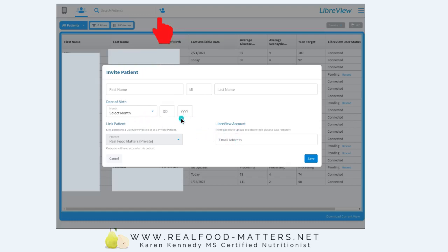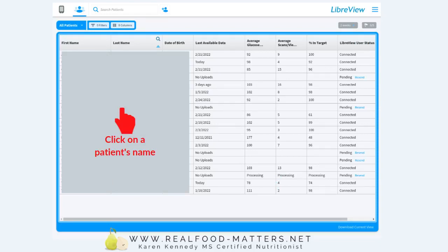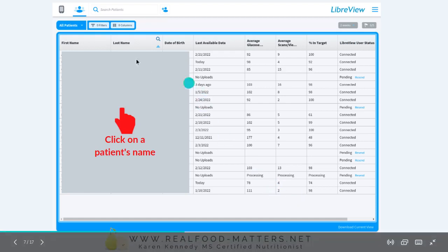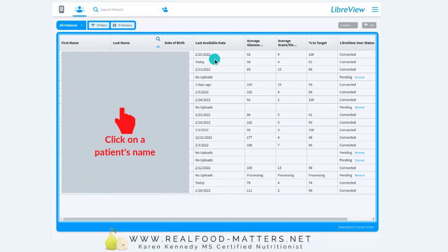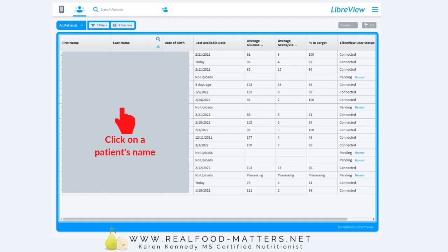Put their name and email in here — they also ask for date of birth, which does not have to be accurate, but you can put it in. Just hit save and the invitation will go to your patient and then they'll be connected on here. This is the page you come to when you want to look at your patients' data. On this page you have your whole list of patients and it is also a quick view to see everyone's average glucose, how many scans they're doing in a day, and their percentage of time in target. This can be a helpful scan to see how everybody's doing and whether people are using their continuous glucose monitors.